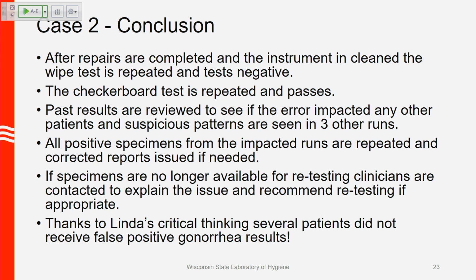All positive specimens from the impacted runs were repeated and corrected reports issued if needed, if there were any false positives identified. Now, if specimens were no longer available, I know we don't all have endless fridge and freezer space. It's always an issue in the lab. Clinicians were contacted to explain the issue and recommend retesting if it was appropriate. Thanks to Linda's critical thinking, several patients did not receive false positive gonorrhea results.